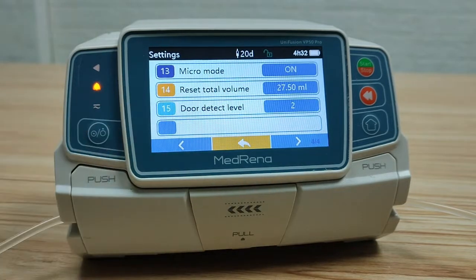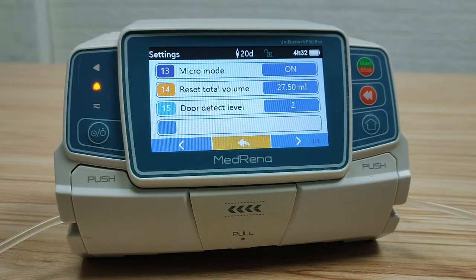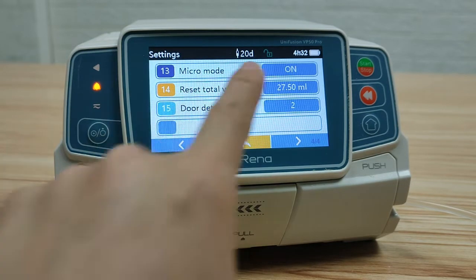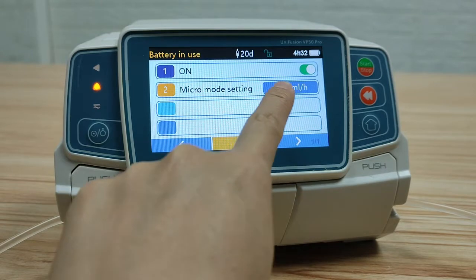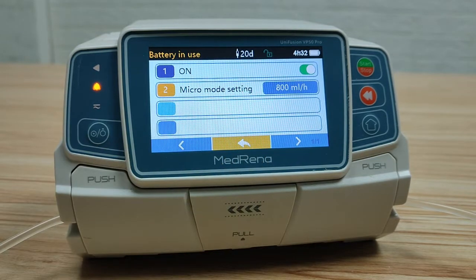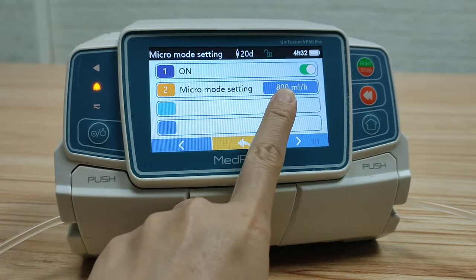Micro mode: the purpose of micro mode is to increase infusion safety by setting a limit on the maximum flow rate. It is used more often in neonates and paediatrics. We can select it on or off. By selecting on, set the max flow rate — by setting this number, the flow rate under all eight infusion modes is not allowed to exceed this flow rate.